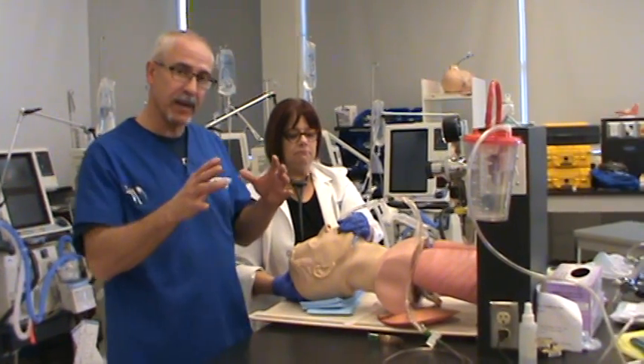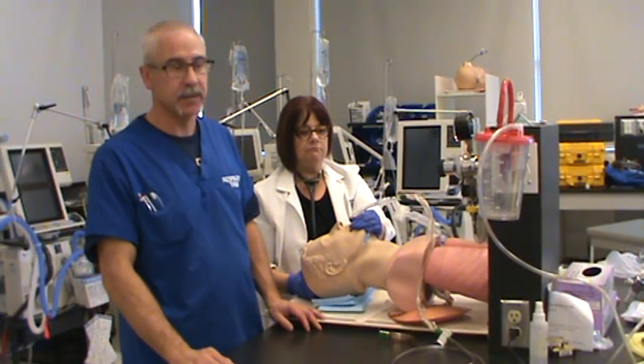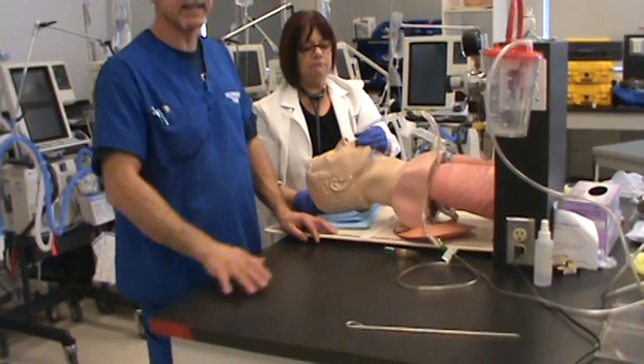The patient's not biting down, not doing anything. They're calm, sedated, not moving. It's really easy to secure the tape to the tube. Make sure the patient's face is nice and clean.